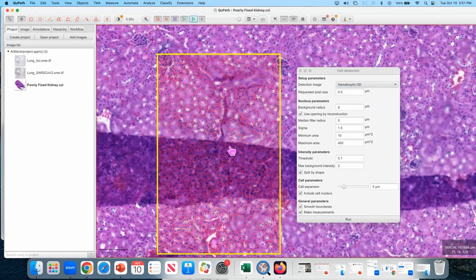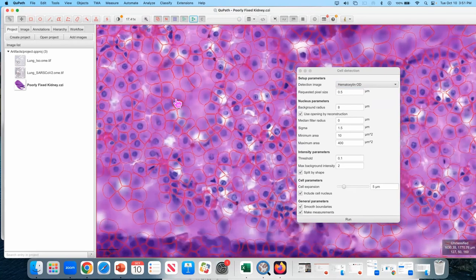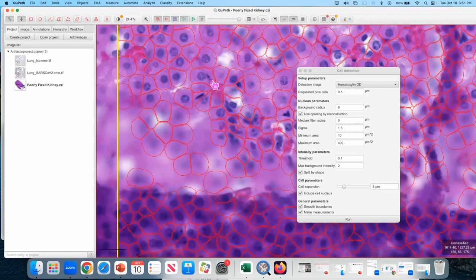This. And there are a couple of things that you can see that are quite interesting here. You see those blurred areas? That's an effect of a bad fixation. That sample didn't want to stick to the glass at all, so it lifted during the staining process. And when a slide scanner scans an image, it scans something that looks like a dome, and that dome makes it impossible to focus on it. There are ways to go around it, but the best is to start with a well-made sample.